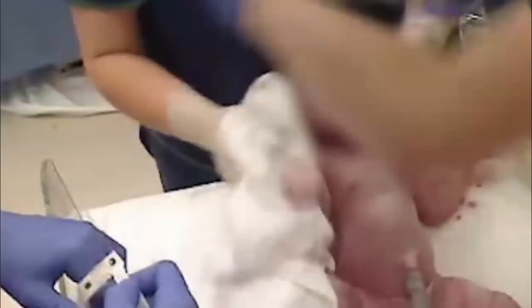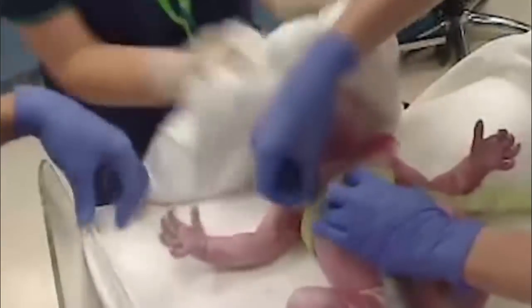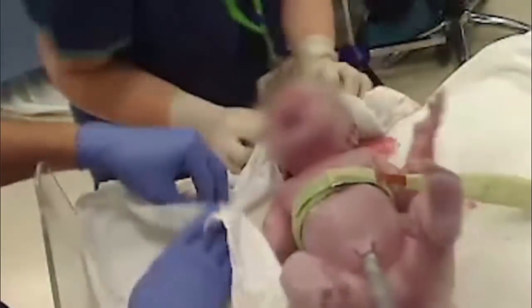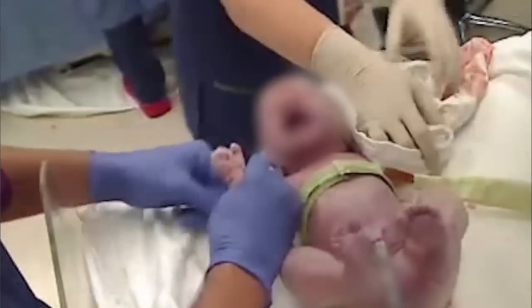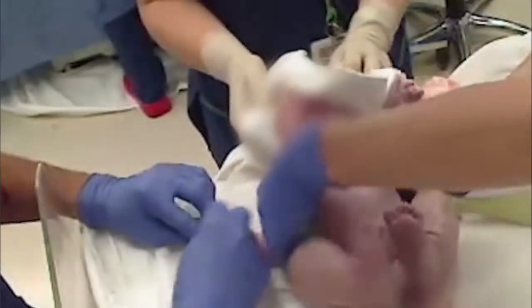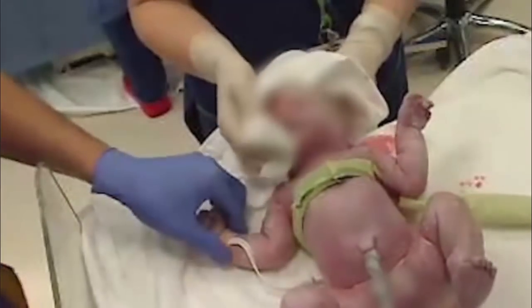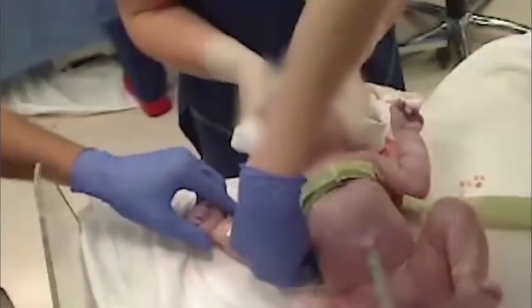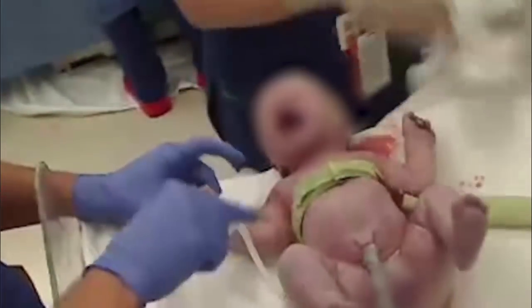Birth is an incredible event linked to the reassurance of a crying baby and the successful commencement of air breathing. The transition to air breathing from in utero life is complex and remains poorly understood in humans. Our study aimed to perform the most detailed imaging of the human lung at birth allowing us to describe this remarkable respiratory process.